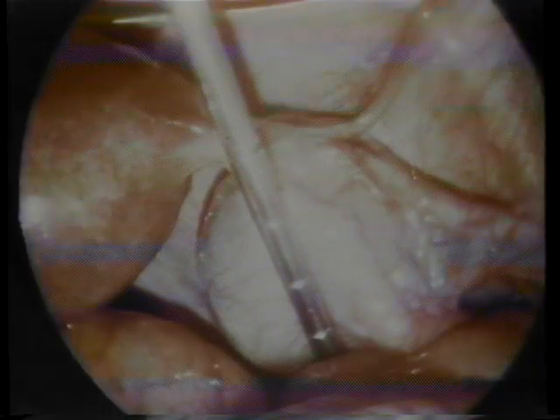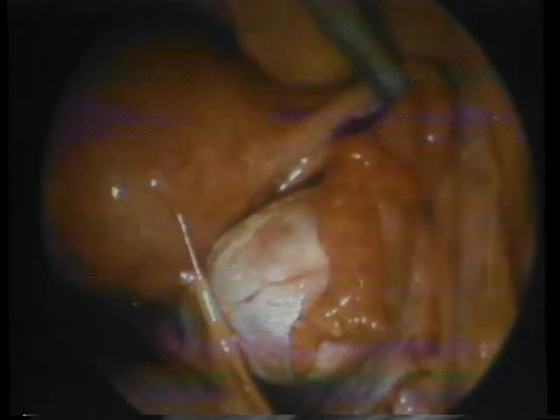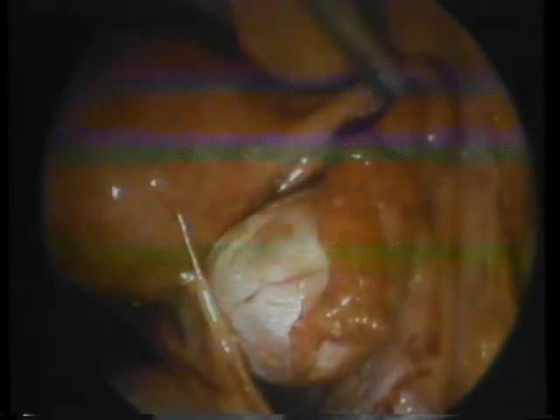Here you see fibroids on the back of the uterus. Adhesions have grown to the back of the uterus.